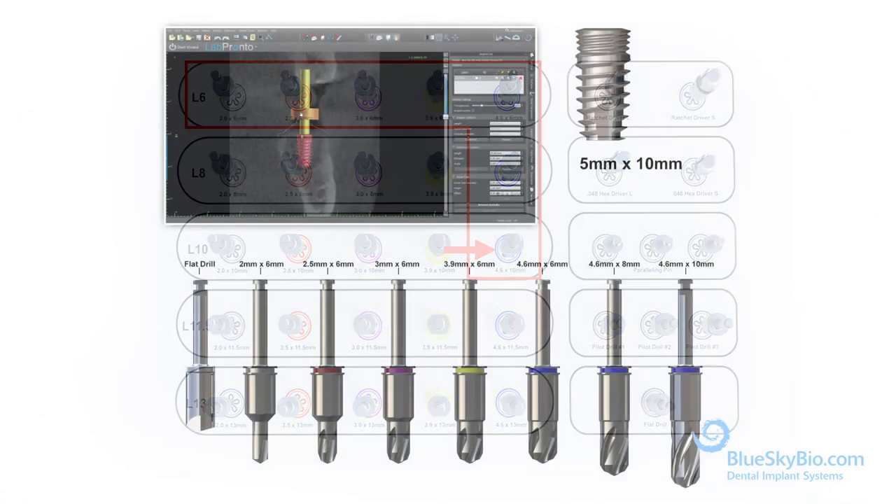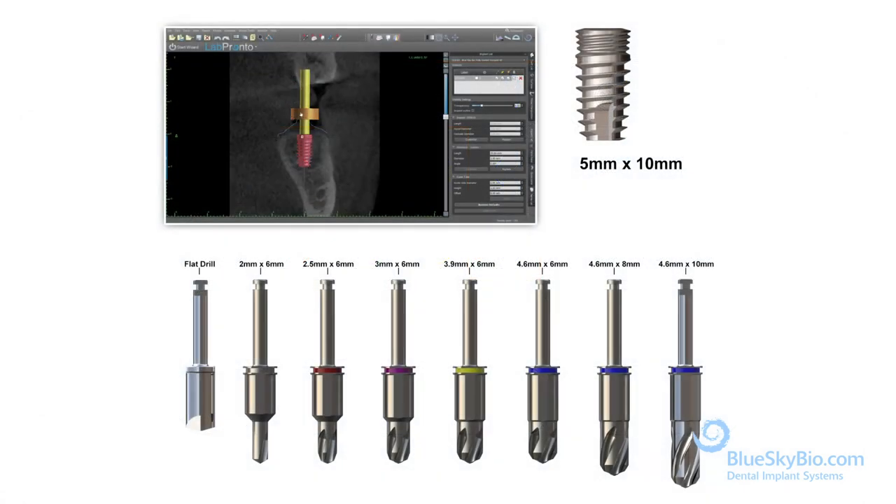When choosing the Bio Max 5 millimeter by 10 millimeter implant, use these specific drills.